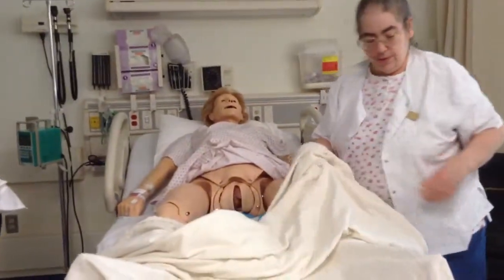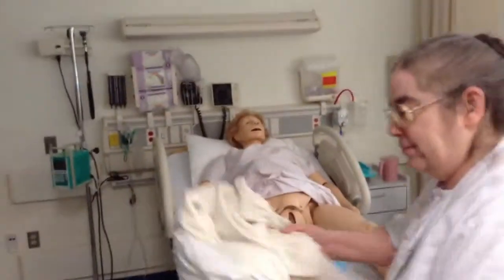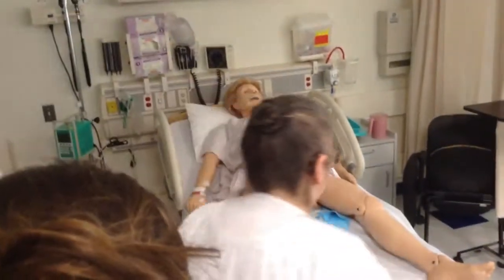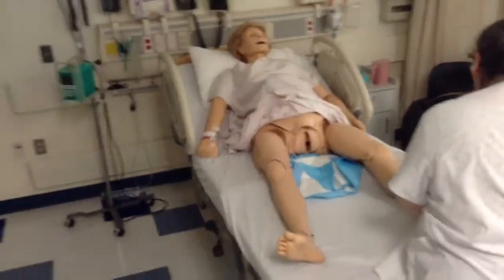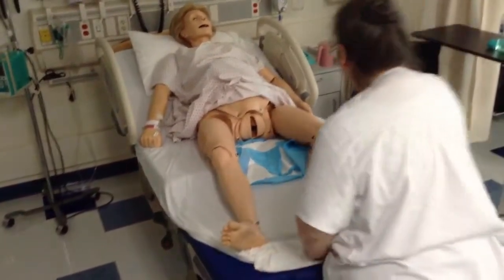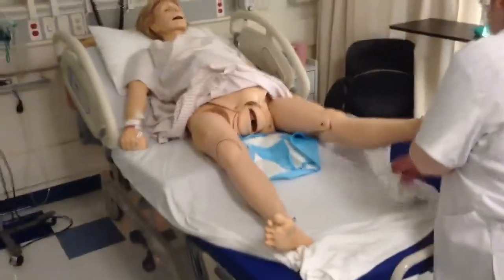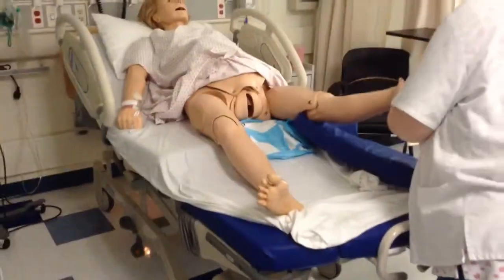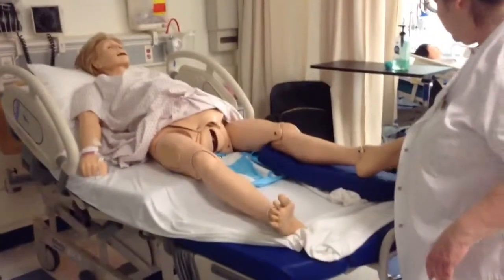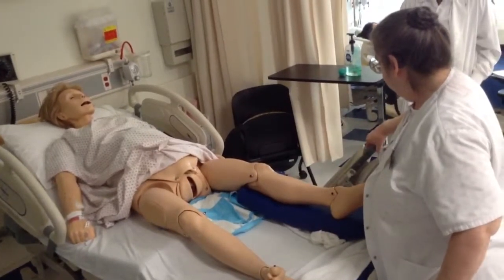So, what you do is you remove the sheets. Put them down. This particular bed, we're going to pull this part off. On labor and delivery at Holy Cross, this has one set of sheets, the bottom half has a different set of sheets, so you don't have to take it off yet. Take them off, fold these in. These things are worked by the handle. You squeeze the handle, you turn it up and down, you turn it in and around. Okay, on the mannequins you can't go very far because the legs don't go very far. In labor and delivery, you adjust it accordingly.